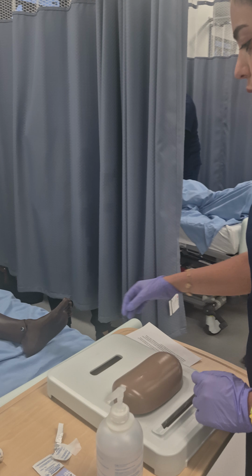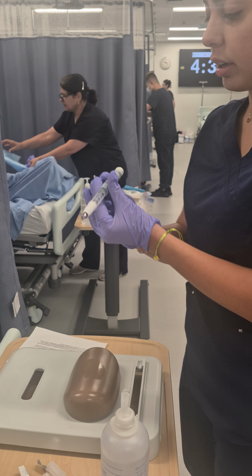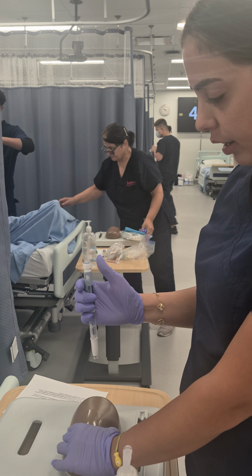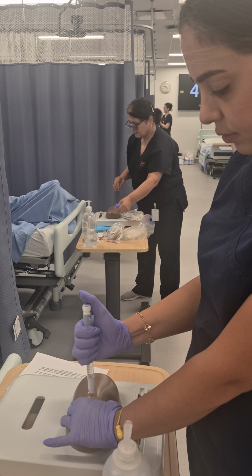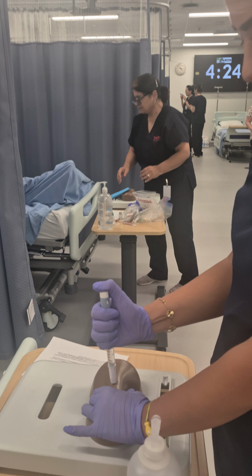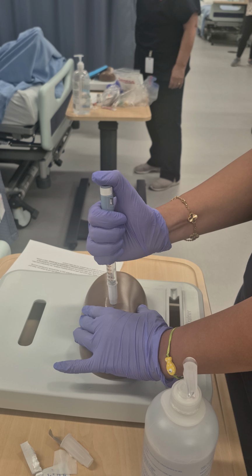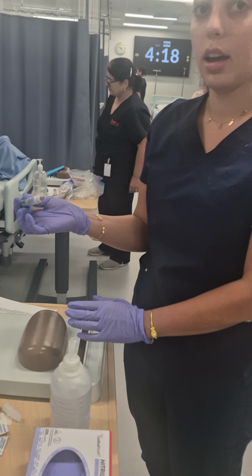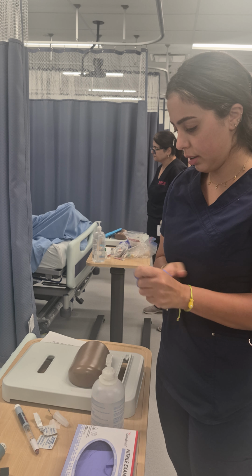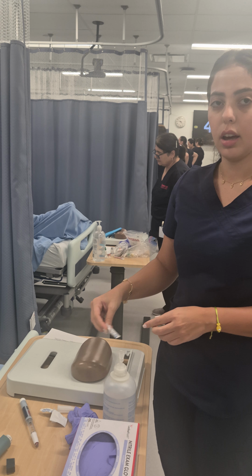I'm also, right before injecting, going to be pinching the skin. So again, this is the 10 units. 90-degree angle. There. And I'll hold for about 10 seconds, and then remove. And that's all. Cleaning the site one more time.